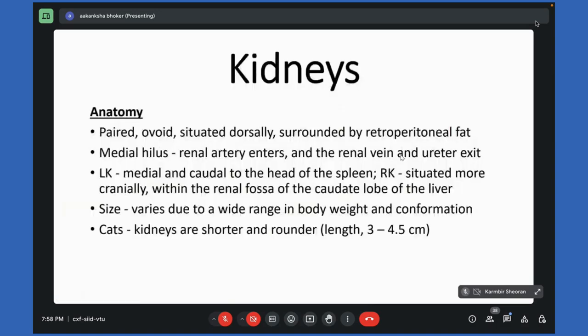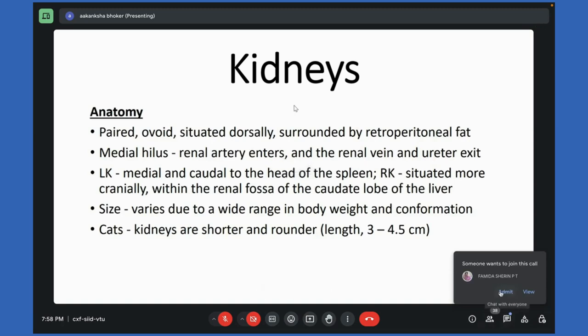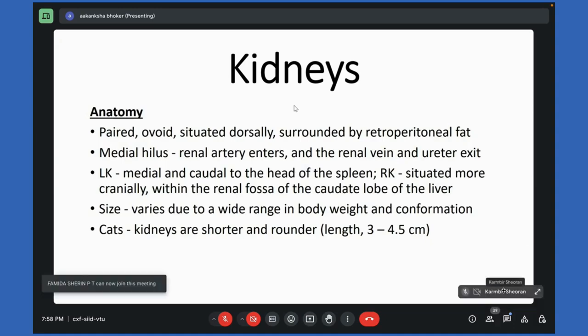After liver and spleen, the next organs we will discuss are the kidneys. They are generally paired ovoid structures located dorsally in the retroperitoneal cavity. In the kidney, we will see a cortex, then medulla, the renal sinus, and a hilus. In the hilus, the renal artery enters, and the vein and ureter exit the kidney.